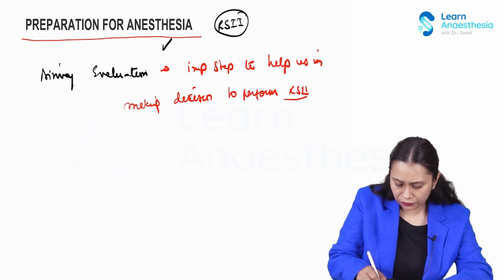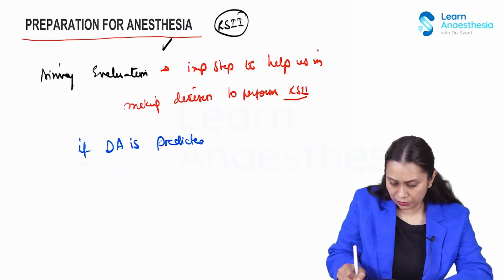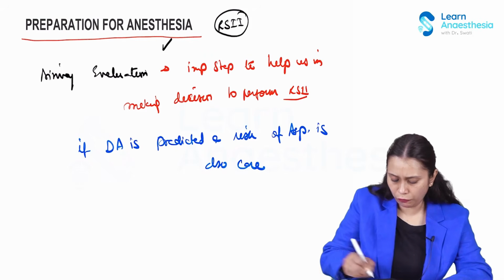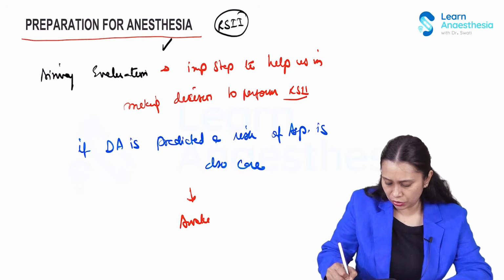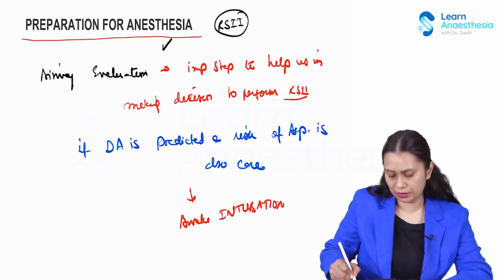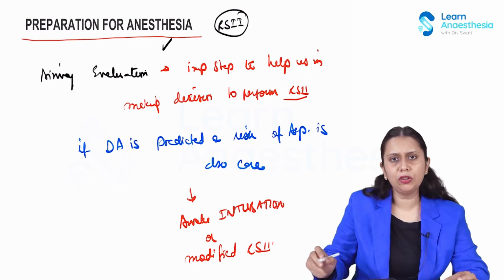Okay, if a difficult airway is predicted, and risk of aspiration is also there, in that case, according to the recommendation, we should go for awake intubation, or we should go for modified RSI, right? So we'll talk about that.